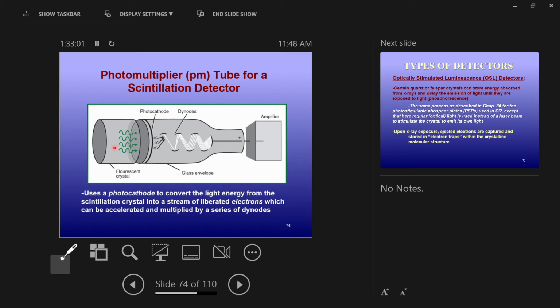No energy was lost. So one X-ray photon comes in, boom, hits the fluorescent crystal. 4, in this case, it's not 4 always, it's never exactly this, but you get the point. The one photon converts to 4 photons of visible light. Those visible light photons now carry potential energy. How much? They carry exactly as much as was absorbed, okay? Now these guys are going to strike this layer called the photocathode, okay?